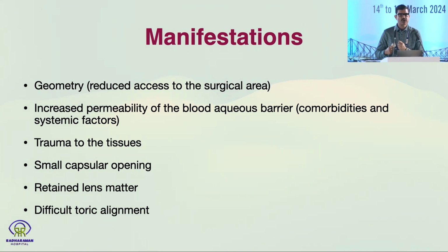The geometry is altered. It's become small. Due to the presence of several comorbid factors, the increased permeability happens of blood-aqueous barrier, and that causes an issue in the post-operative period. Particularly, you have to manage AC reactions more. There is a possibility of trauma to the tissues because the iris and the other tissues are closer to you. Small capsular opening, because it's a blind technique, you never know what's the adequate size of opening that you're making.